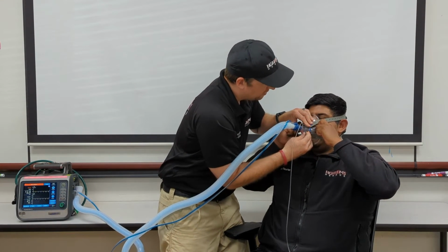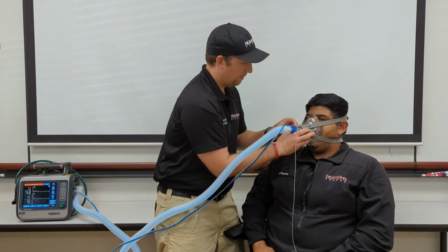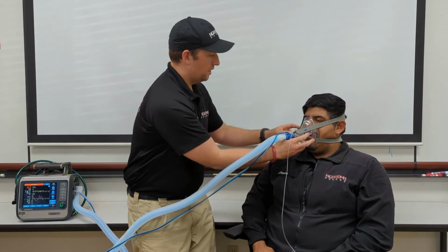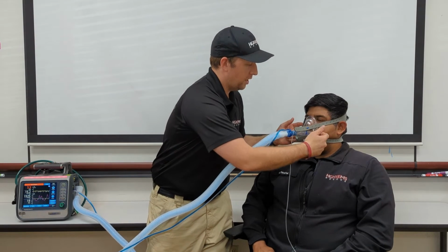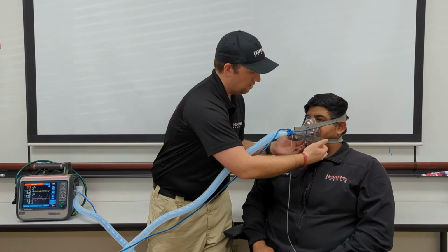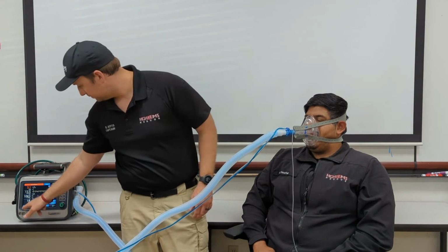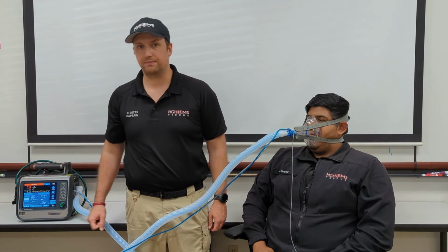Okay, I have the mask. You can already see it's pulling off its post. Perfect. I'm going to run my fingers around. It's already pulling. All right, run my fingers around. I don't feel any obvious leak. Then we'll go to the monitor. Monitoring, page 2, V leak, 0%.